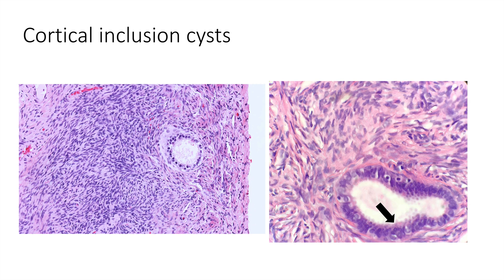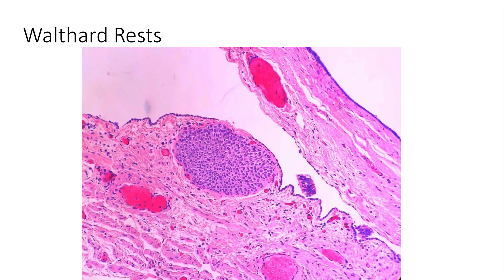Cortical inclusion cysts are presumed to be invaginations of the surface epithelium. They can show cilia, as in the picture on the right. Walthard rests have been suggested to represent urothelial rests within the gynecologic tract. They're often located in paratubal or hilar tissue and can become cystic and even show mucinous change.